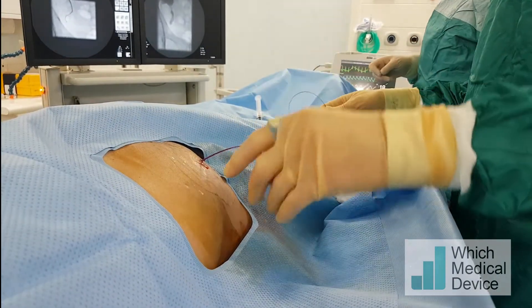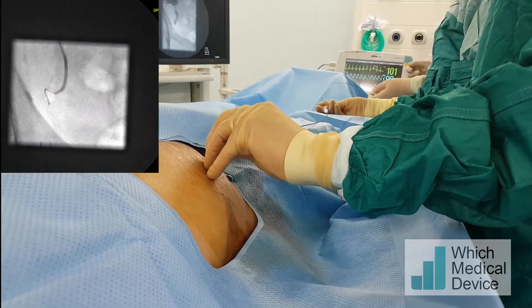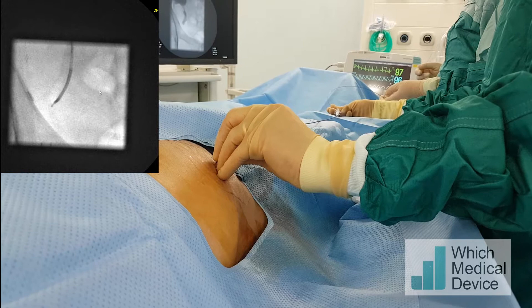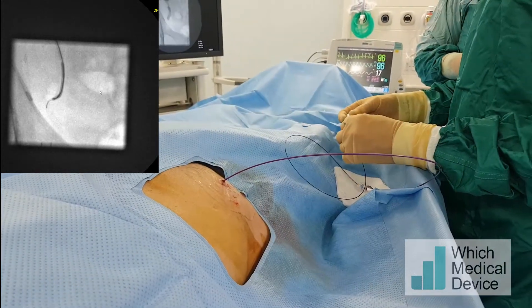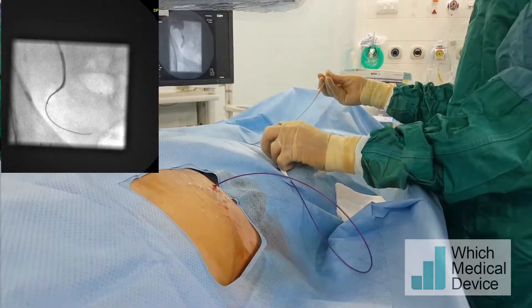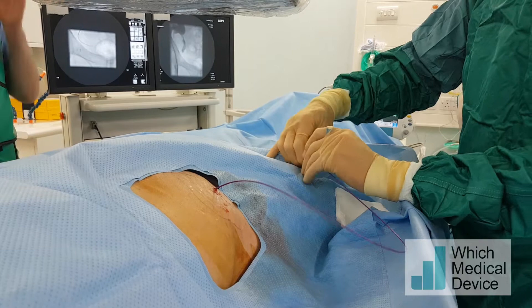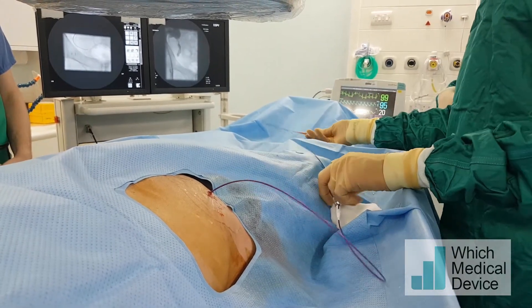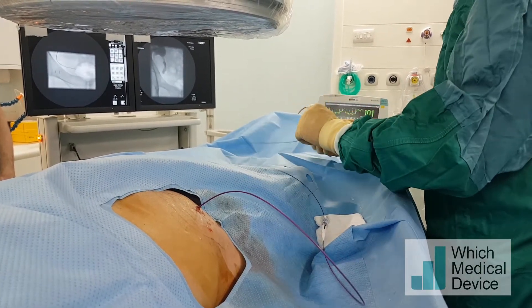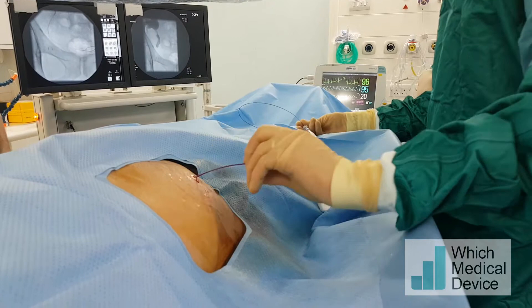I'm going to take my supporting catheter down and try to get it right up against the stricture. I'm loosening the valve off slightly to allow me to advance the catheter more and hopefully get it to follow the guide wire towards the bladder. It really is incredibly tight. I'm going to get more guide wire into the bladder — my catheter has backed away, so I need to get it down there for more support.